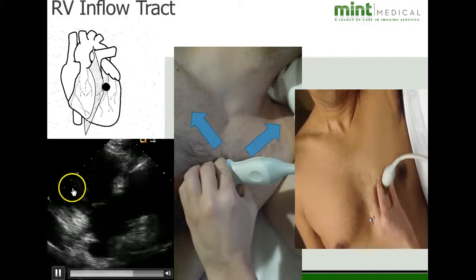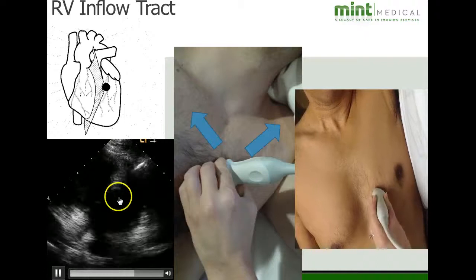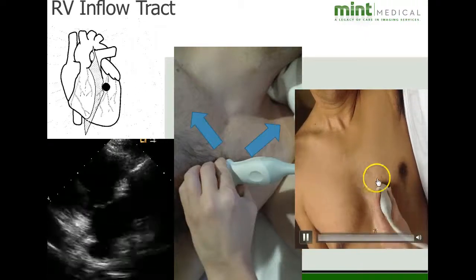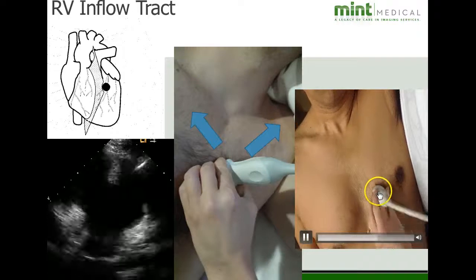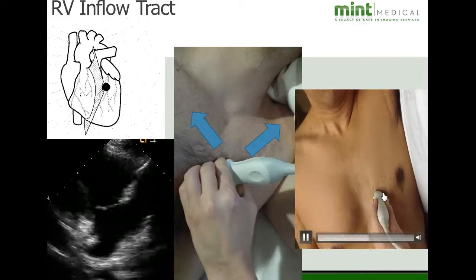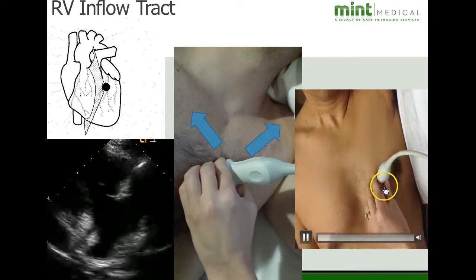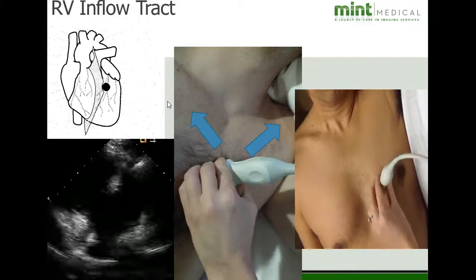ventricle and right atrium, with the tricuspid valve in the middle. And here's the movement you'll see over here. You'll start from a parasternal long axis and tip it towards the patient's left shoulder. So once again, tipping it towards the patient's left shoulder. Indicator towards patient's right shoulder.